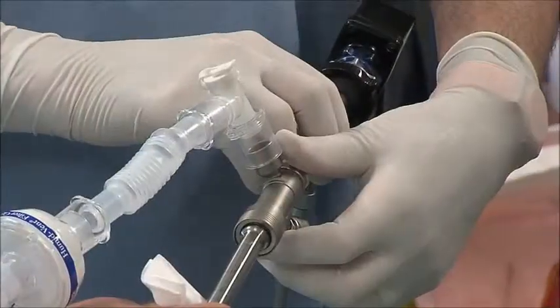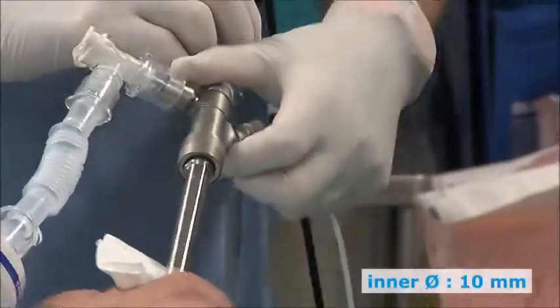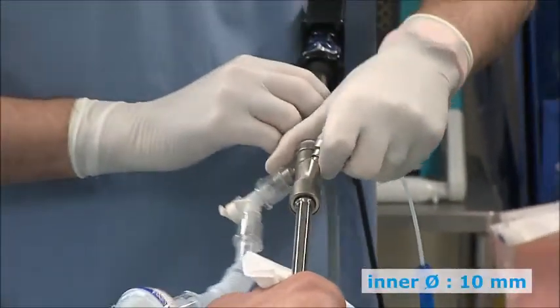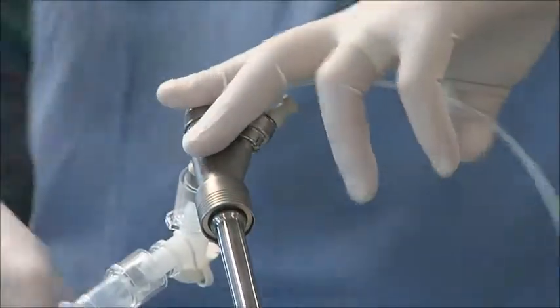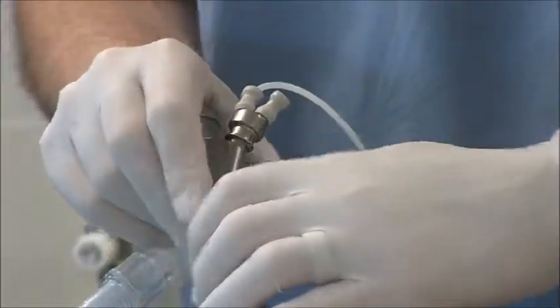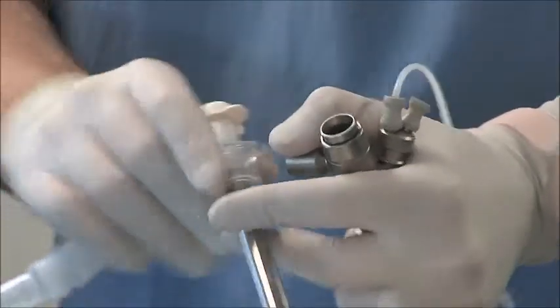We recommend using rigid bronchoscopy for more safety for the patient. Inner diameter of bronchoscope: 10 mm minimum. Ventilation must be ensured without interruption. The ideal is jet ventilation. Patient obviously under anesthesia.